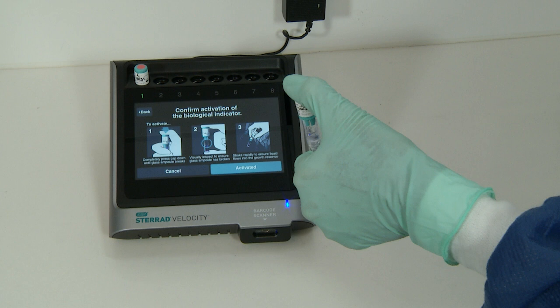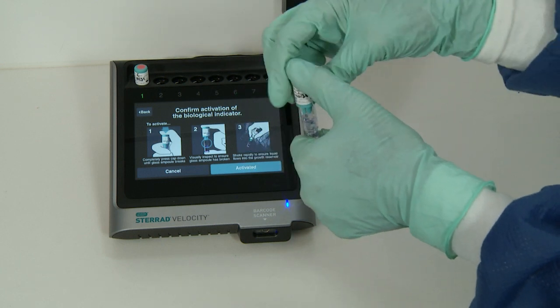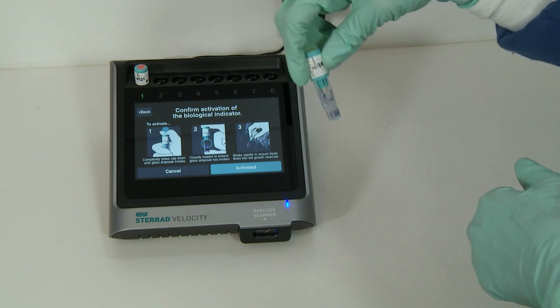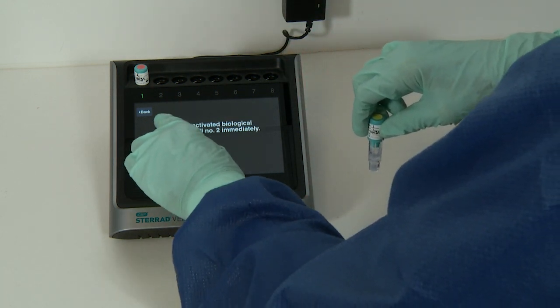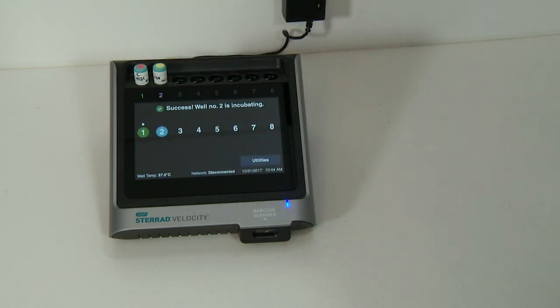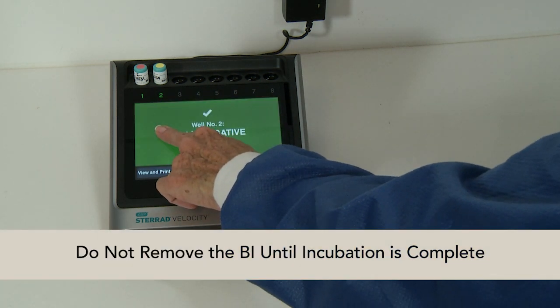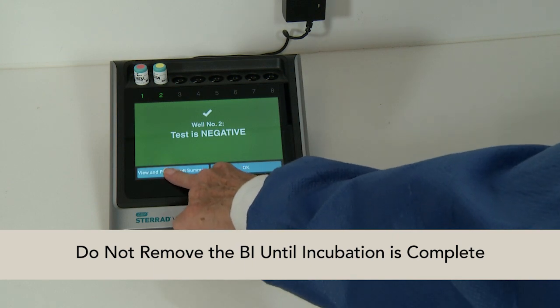Finally, activate the BI before placing it in the reader. To activate, completely press the cap down until the glass ampule breaks. Then visually inspect to ensure the glass ampule has broken, and shake it rapidly to ensure liquid flows into the growth reservoir. Failure to do so may result in incorrect reading. Once complete, place the processed BI in the selected reader well. Test results will be available in 30 minutes. Do not remove the BI until incubation is complete, as doing so will void the BI.